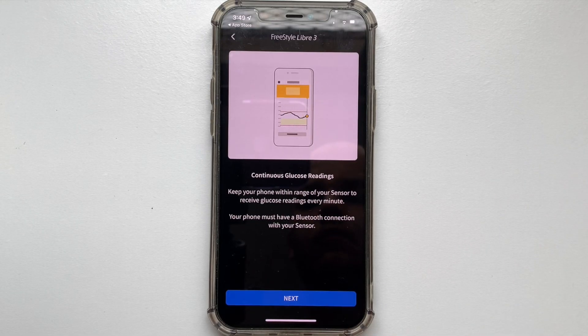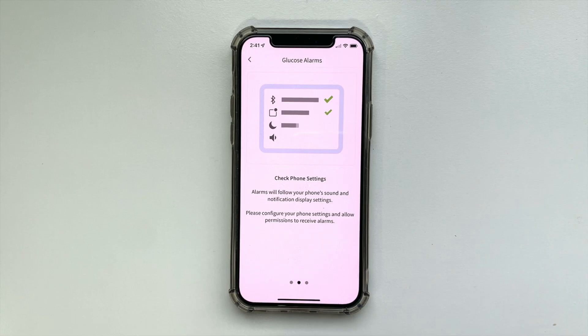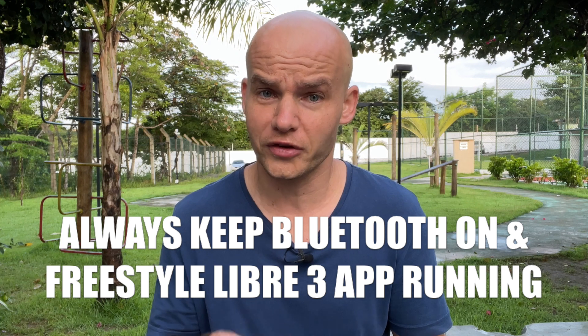Click Get Started and you will be taken through a few slides with introduction and initial instructions. When you use the system you need Bluetooth, because that's how the glucose data is transferred from the sensor to your phone. So make sure your Bluetooth is turned on.